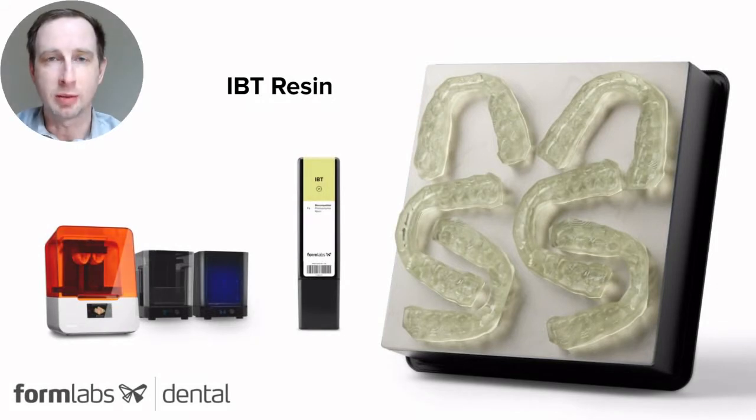Hello, my name is Sam Wainwright, Dental Product Manager at Formlabs, and today I'm excited to talk about a new product from Formlabs, IBT Resin.